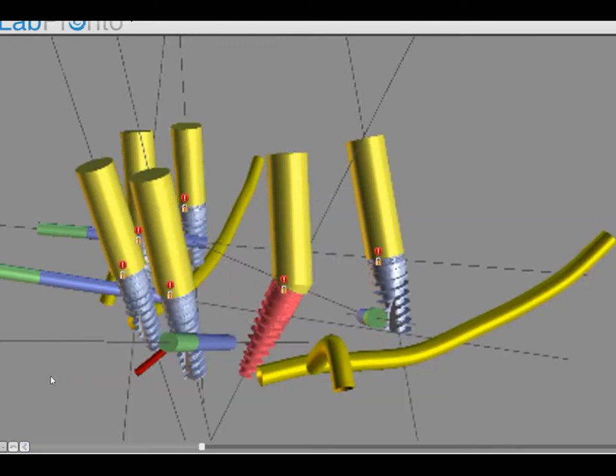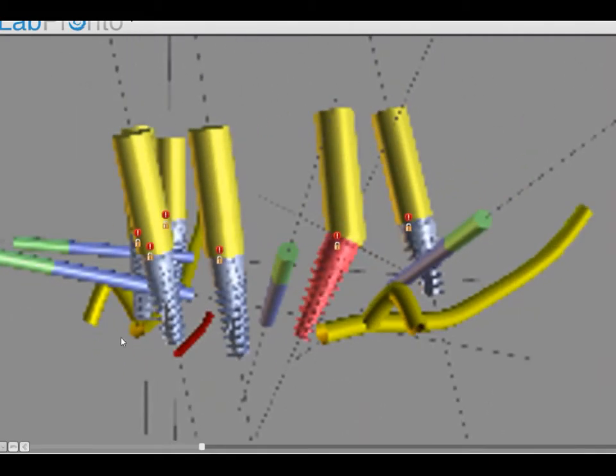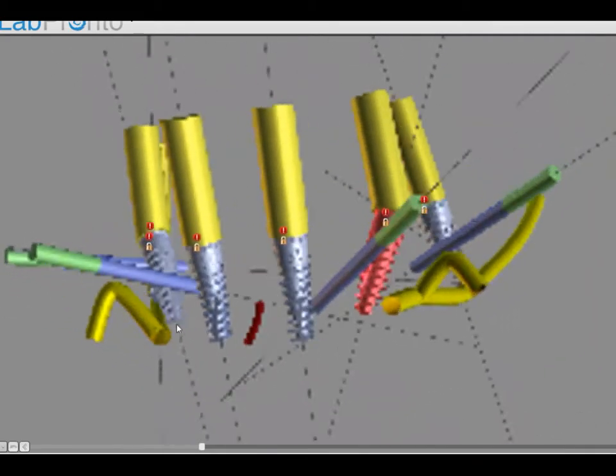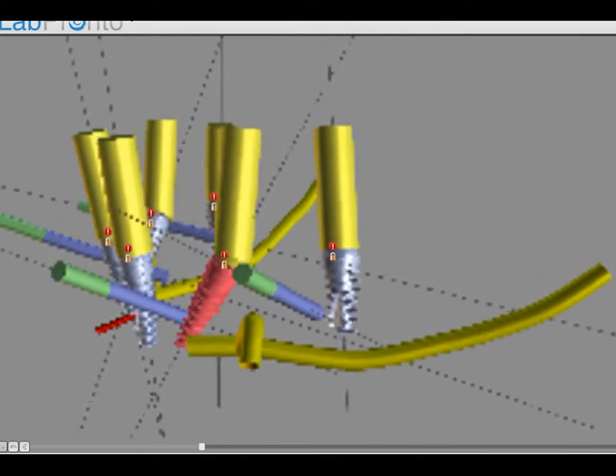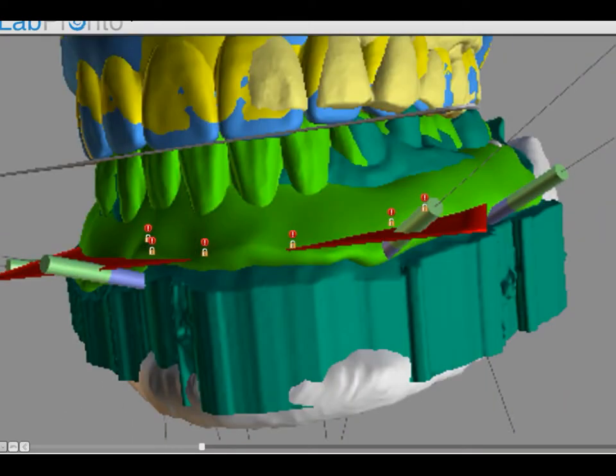The bone off. So this would have been an all-on-4 configuration in the anterior, but then just for stability and to avoid cantilevers and give some more support to the prosthetic, decided to add implants in the posterior as well.